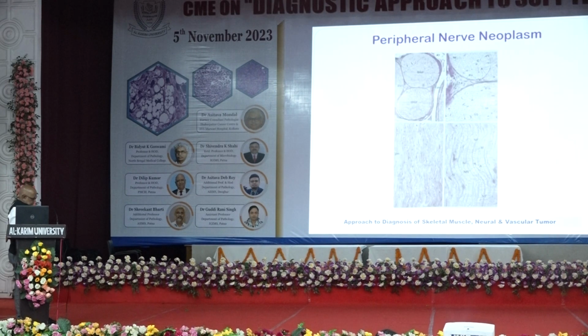And the cross section of this nerve fiber. This is the bundle of nerve fibers. There is a perineurium here. When you say perineurium, where is the perineural cell? We don't know where. You must know the location in normal histology. It arises from these nerve bundles. The perineural cell is there. So this is a tumor of perineural cells. This is just for briefing this histology.